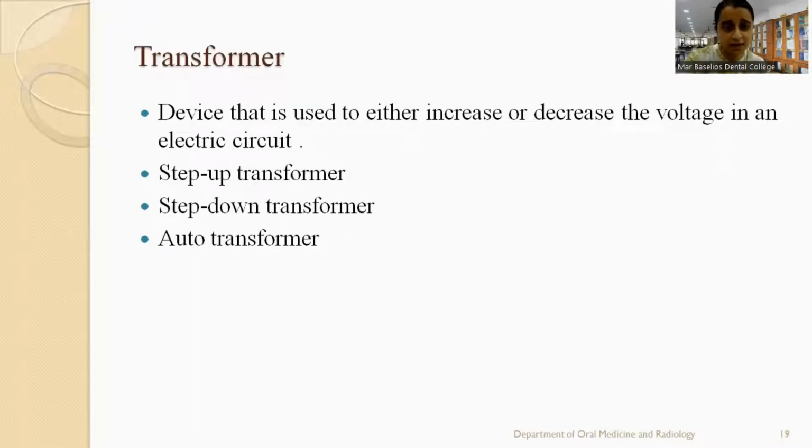Now there are transformers which help to increase or decrease the voltage in an electric circuit. That is a step-up transformer and the step-down transformer.